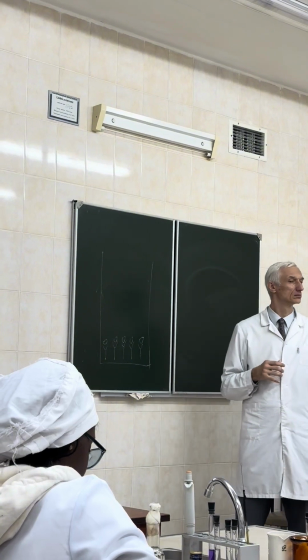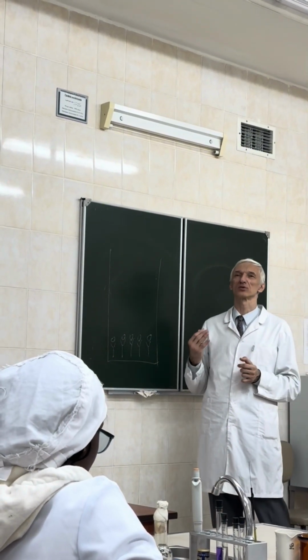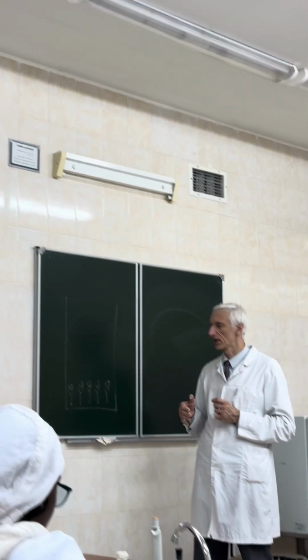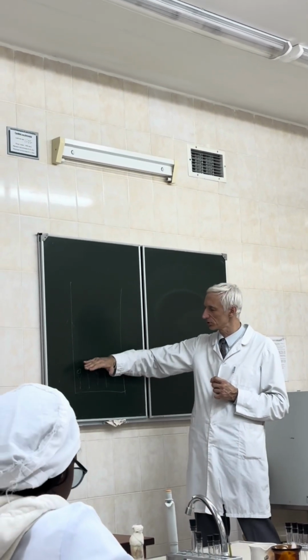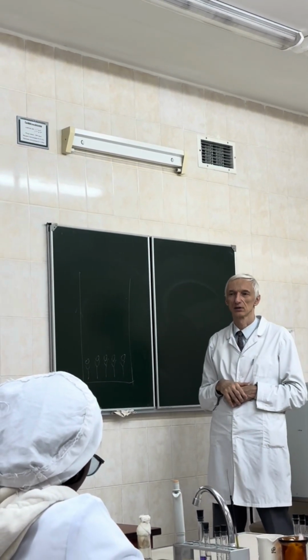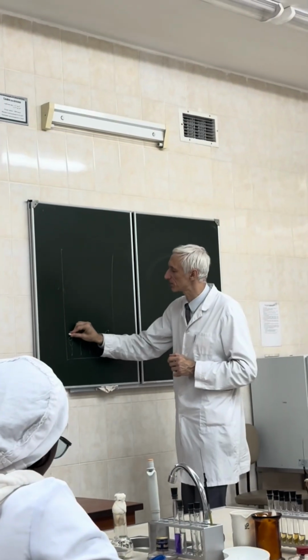No? Antiserum is all the time produced against what? What will be the target for it? So people, here everything should be imagined a little bit mechanically. Like bottom layer antibodies, upper layer antigen. What to add next? Again the same antibody specificity.